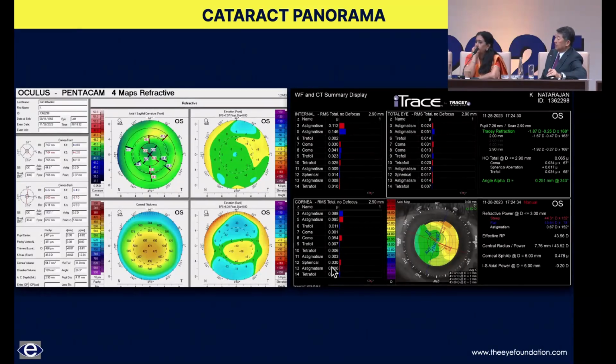And you have a little idea, because of your calculation outcome in the first eye, whether you feel confident doing that in the other eye. So just in general, and I spoke about this yesterday at the ISRS, I'm doing a lot of mixing a refractive EDOF in the dominant eye and a trifocal in the other.